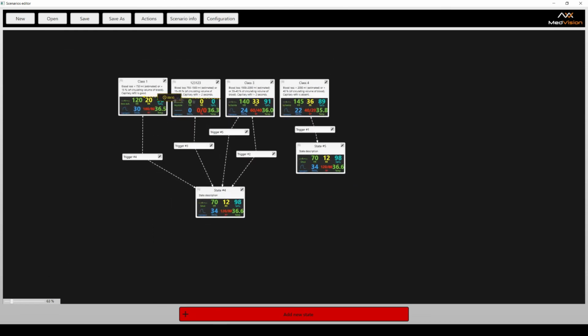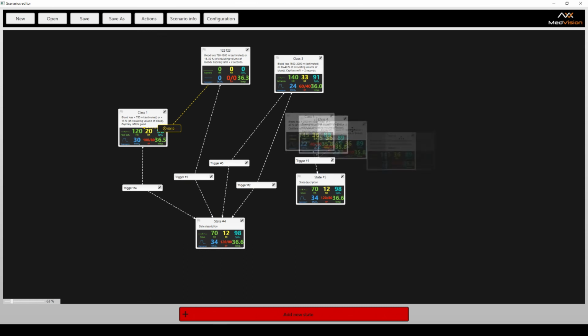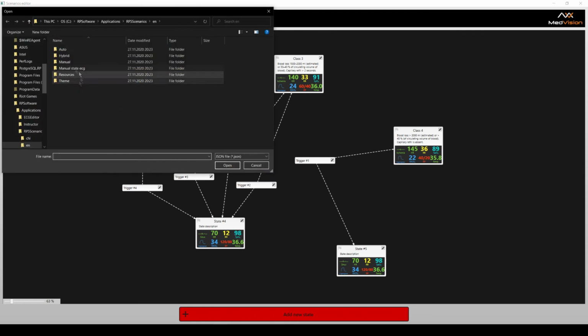And what I like about this is it can be very nice and visualized, and you can spread them out like this to help with your process right there. So you can see our triggers right here. You can see the 10 seconds transition time to this state. If, for example, a trigger is not performed, let me try and show you some other scenarios we have in here.